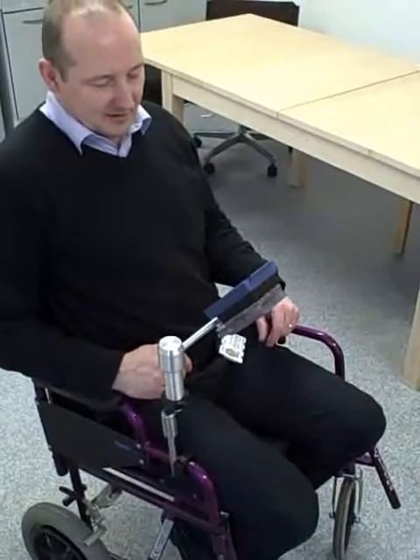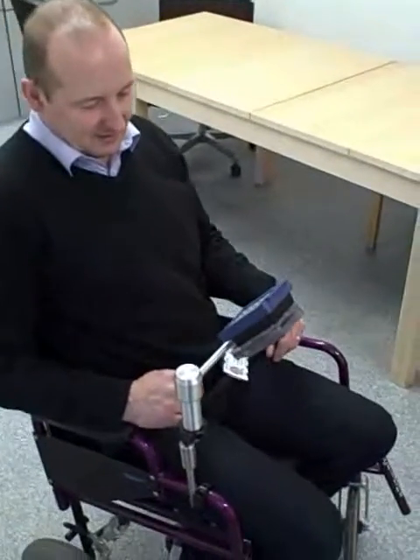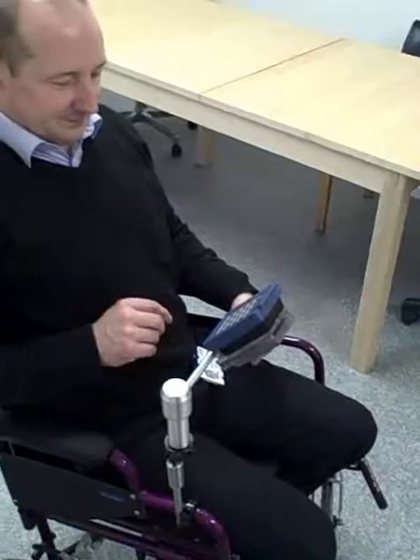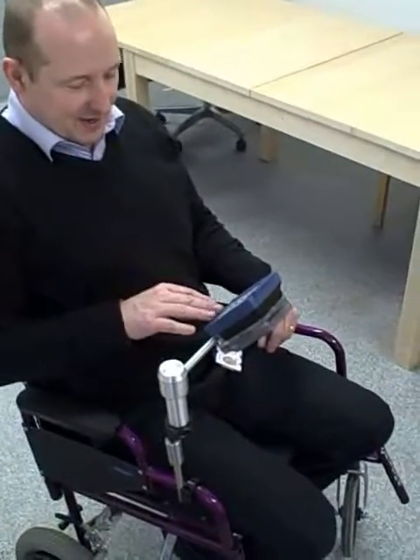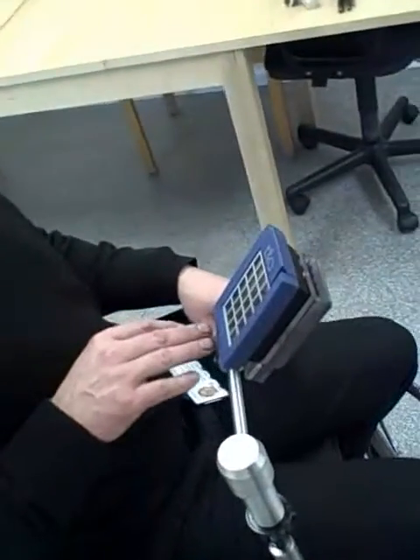This is to demonstrate the magnetic mount that Michael has developed. Michael is sitting in the chair demonstrating it. Do you want to explain what it is, Michael? Yeah, it's a KO environmental control.